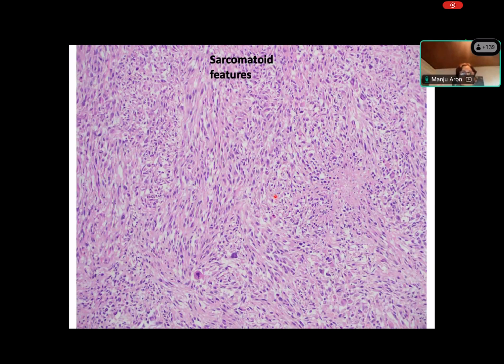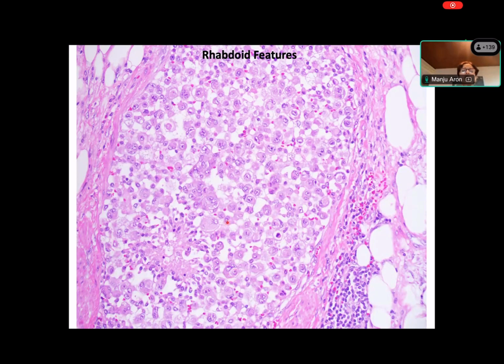Now, as I mentioned, you can get sarcomatoid features. If you take sections from those solid white areas, you will see a growth pattern where the tumor cells are spindled in appearance, growing almost in fascicles. That's sarcomatoid tumor. Sometimes you can have areas within clear cell RCC where the nuclei are eccentric and you have this inclusion-like cytoplasm, and those are the rhabdoid areas within the tumor.